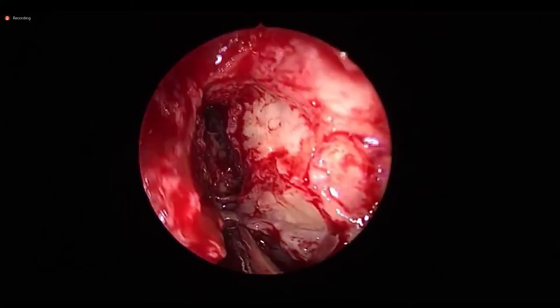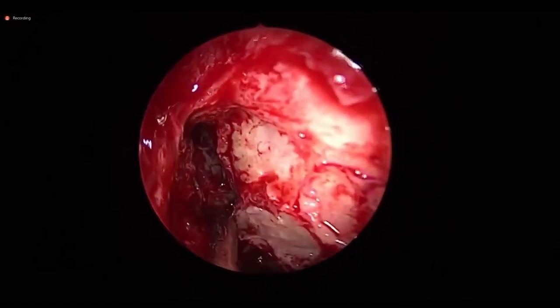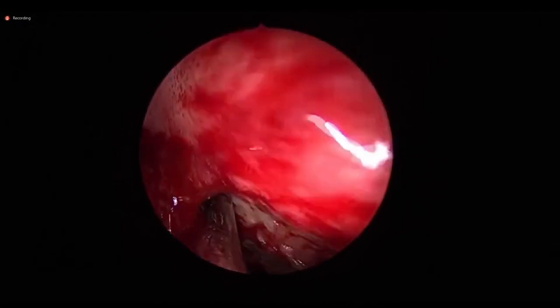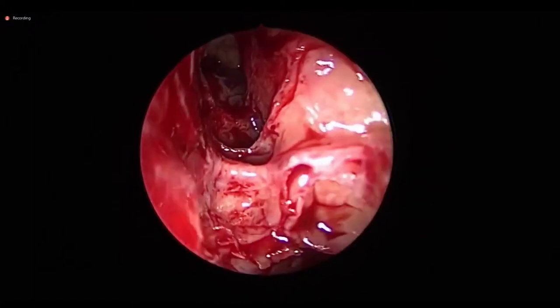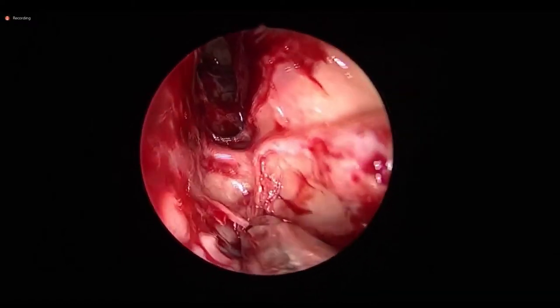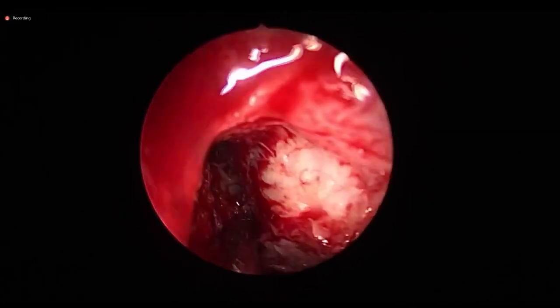Flush the skull base. Sir, have you counted how many cells are there on each side? Why count? Can you see the vessel there? See, this is the skull base. The vessels run along the skull base.